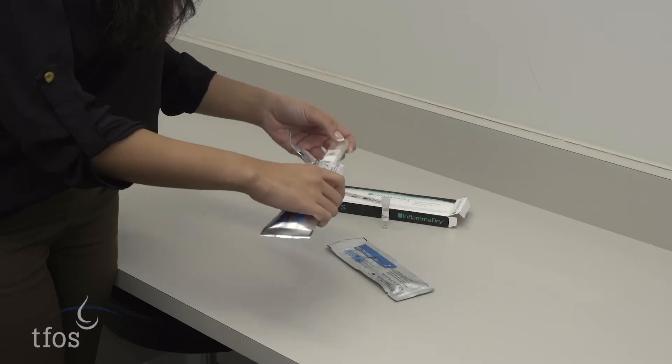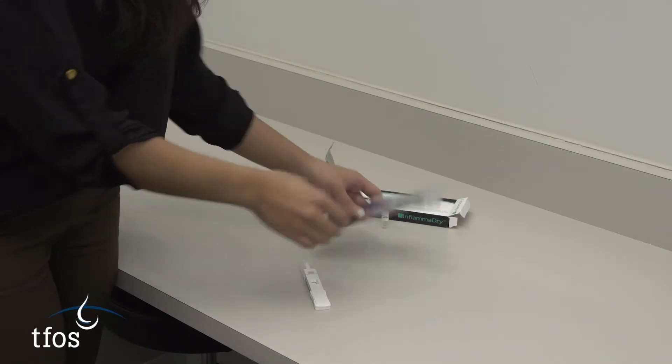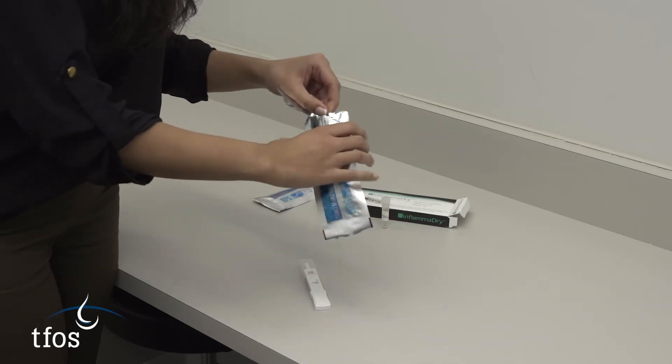The two sealed packages are opened to reveal a plastic test card with a fleece tip and a plastic holder. Both should be opened prior to collection of the sample.